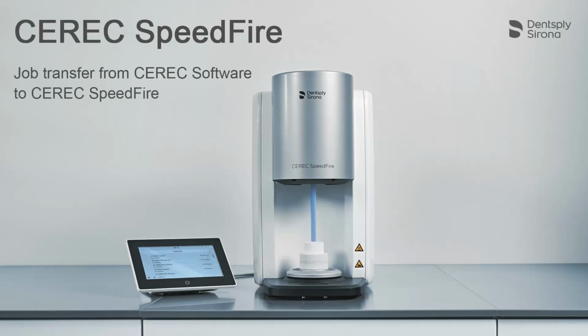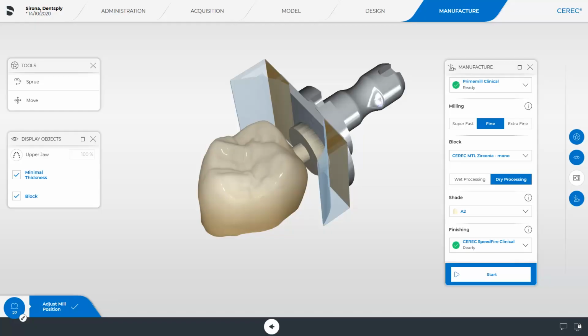Welcome to this video tutorial on the CEREC SpeedFire. In this video, we explain the necessary steps in the CEREC software to ensure a furnace job is transmitted without errors. Additionally, we will address possible causes of CEREC SpeedFire being unavailable in connection with the CEREC software and how to resolve these issues. We are now in the last phase of the CEREC software, the manufacture phase.